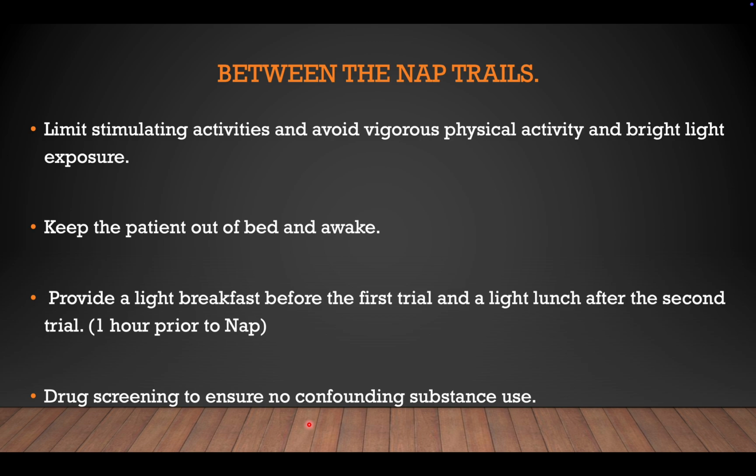Another thing is that you have to plan the breakfast and the lunch well in advance, so that there is at least a 1 hour gap between the breakfast and the first nap, or between the lunch and the subsequent naps. Drug screening, sometimes physicians do request for that, and it has to be done to ensure there is no confounding substance use.